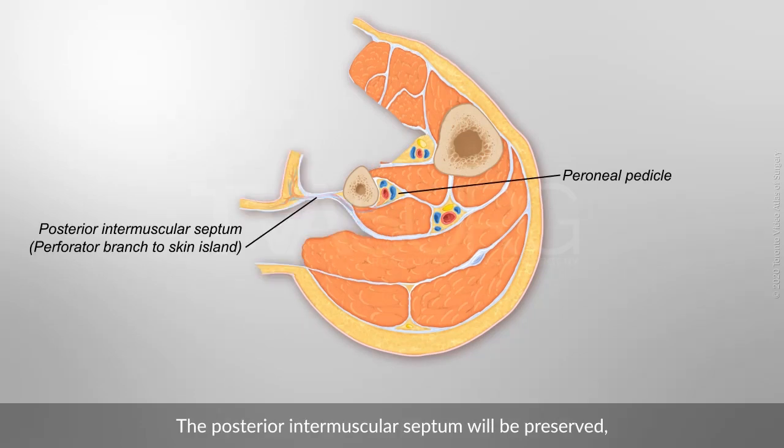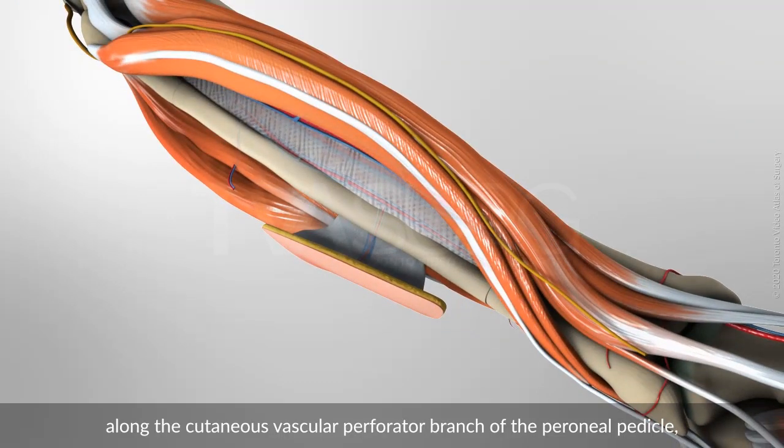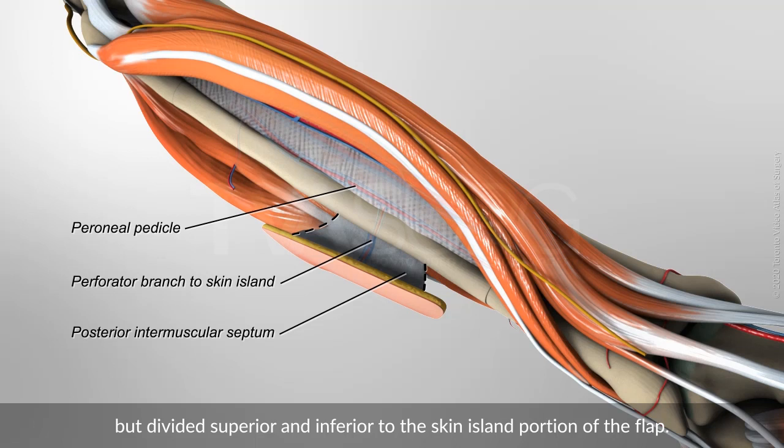The posterior intermuscular septum will be preserved along the cutaneous vascular perforator branch of the peroneal pedicle, but divided superior and inferior to the skin island portion of the flap.